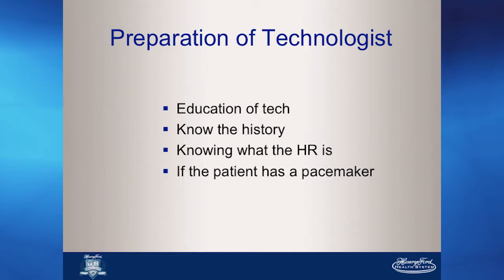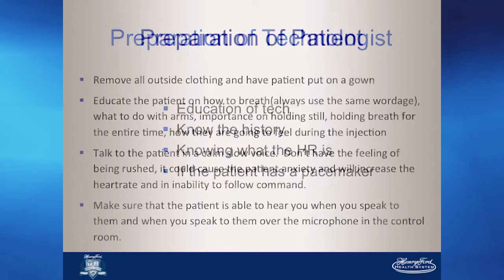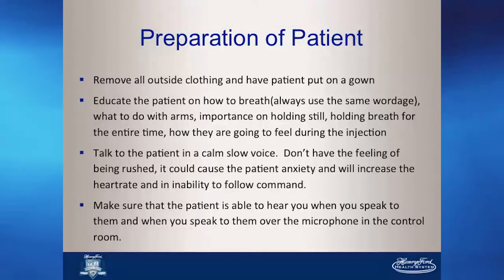Make sure that we are doing the right study. So our techs are comped. They're trained for this particular exam. I go in with them, walk them through, and let them perform as many as possible until they're comfortable. We comp our techs at least 10 patients in, and then they can do them unassisted. And once they are comped, they are able to go ahead, and I don't have to be at the scanner anymore.